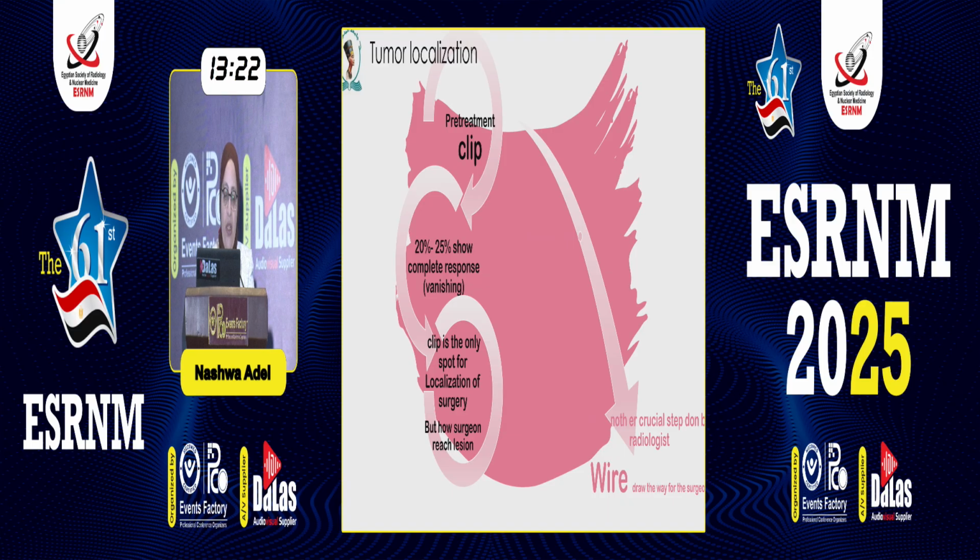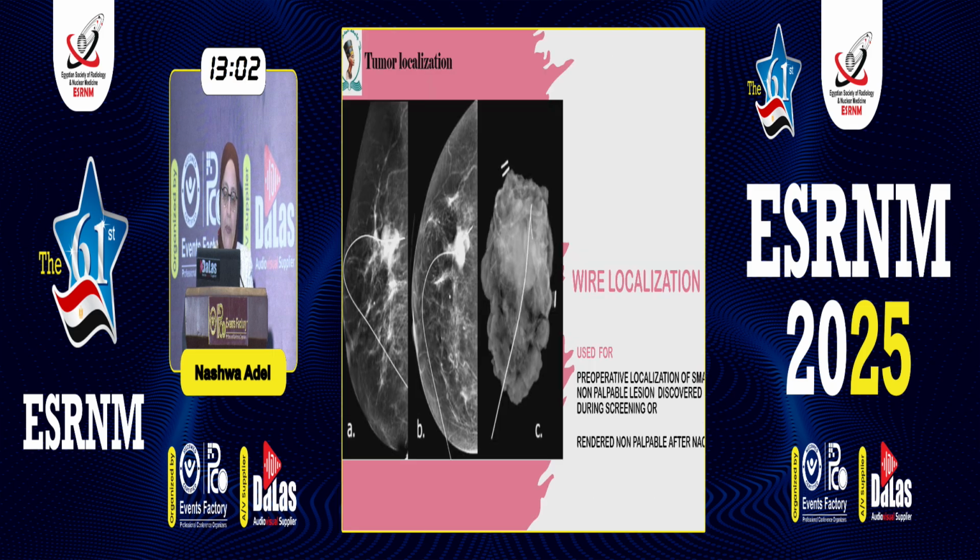So with a pre-treatment or during-treatment clip, 20 to 25 percent show complete response. Then the clip will be the only spot for localization for the surgery. But how does the surgeon reach the lesion? This is a new crucial step done by the radiologist, which is the wire, which draws the way to the surgeon.